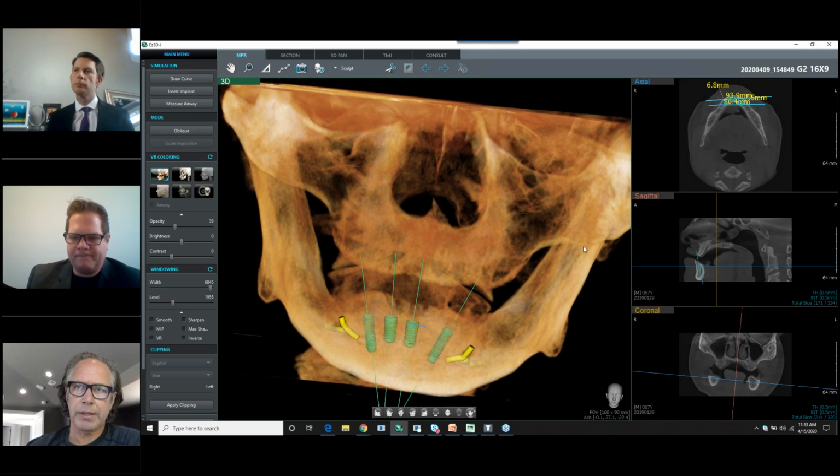Guided surgery is just a phenomenal field, as we all know, and this is one extreme part of it. I call it the peanut butter and jelly sandwich, right? So with respect to your question, Jim, in terms of the communication between the patient, here's my feeling. Let's go back to November, when life was a little bit different for all of us.